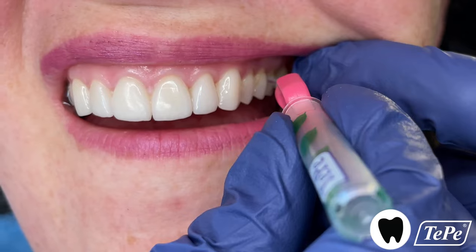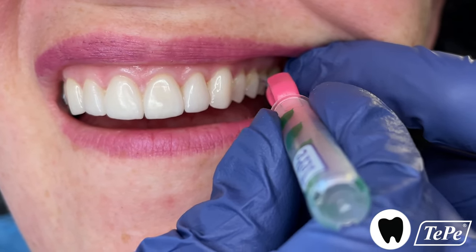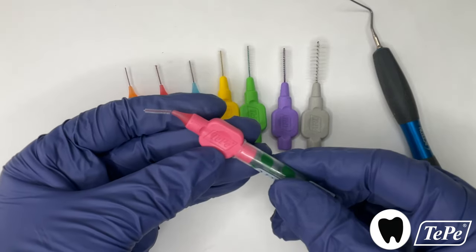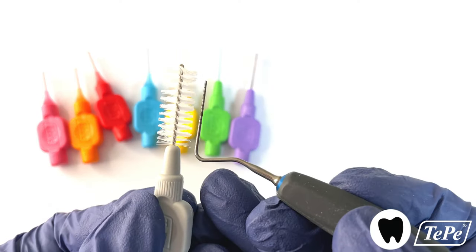To access the posteriors, you can lengthen the handle by attaching the ventilated cap to the end and then bend the bristled tip to get that right angle. This larger gray Tepe size works very well in larger spaces, such as in the case of missing teeth.